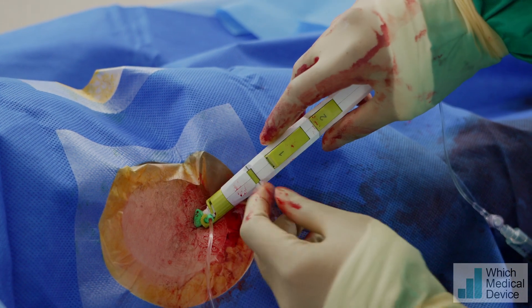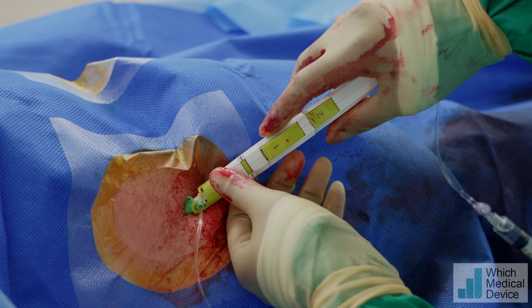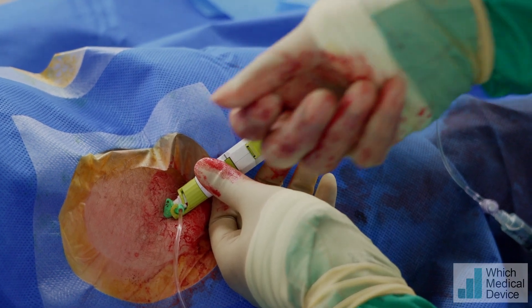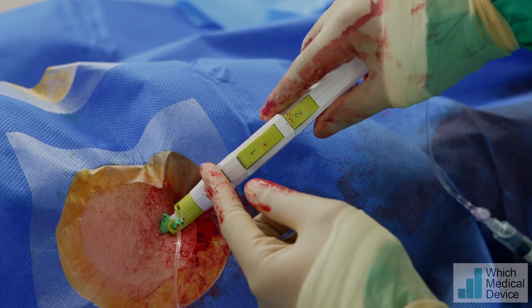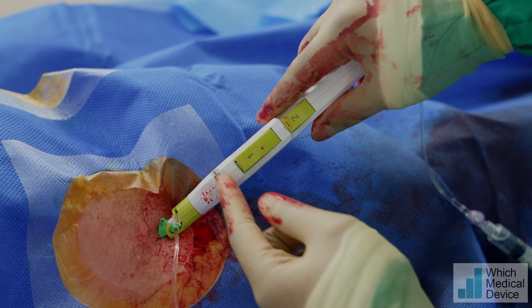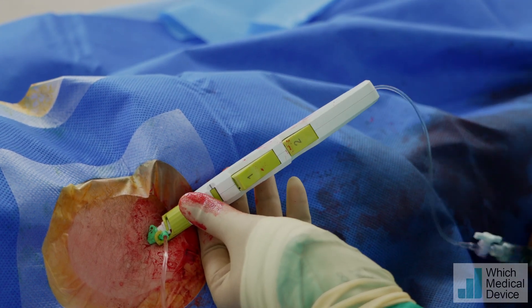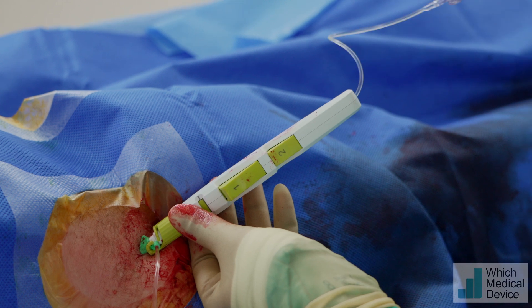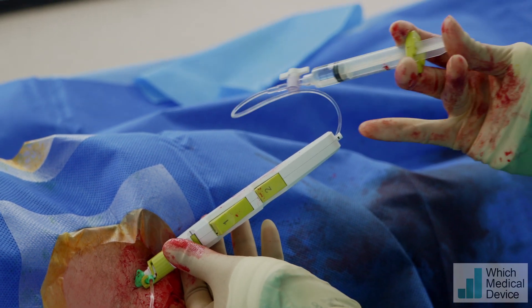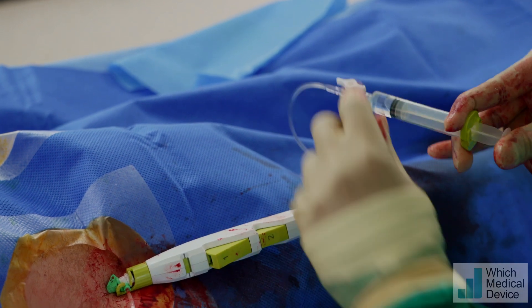If you notice there's a little blank marker here — when the balloon goes up you'll obviously be inside the vessel, and when I'm pulling back you'll see a line in the middle. What we want is for it to be in the middle of those two lines, which shows us the optimum position of the balloon. We've got the balloon syringe loaded, so I'm going to inflate that. Now we know: white, black, white — the balloon is inflated. I'm going to lock that on here.